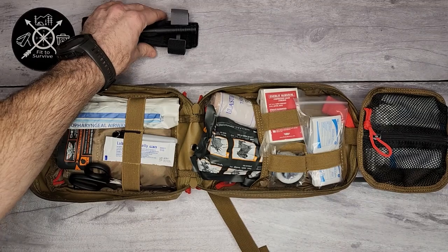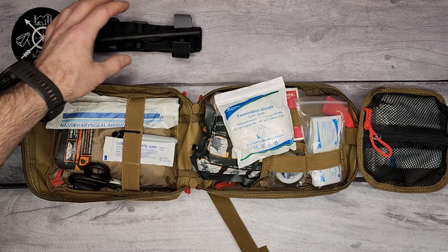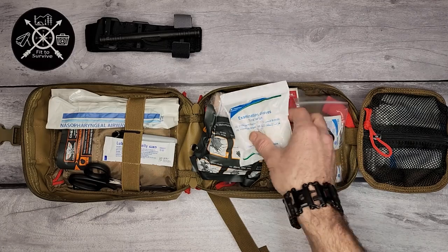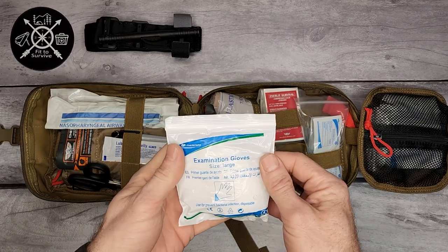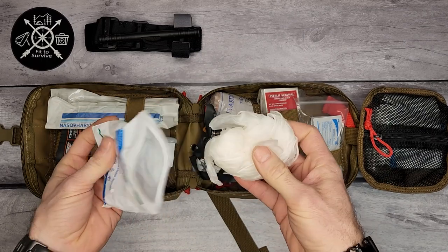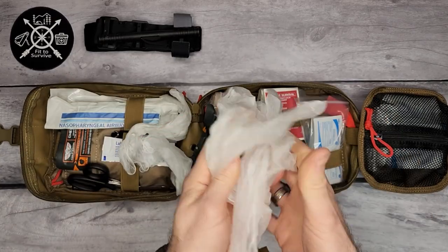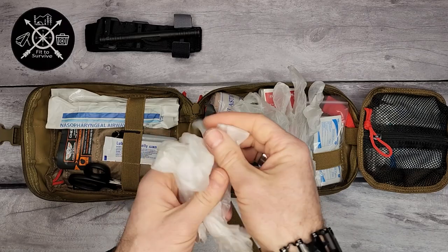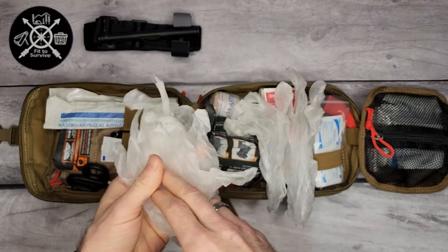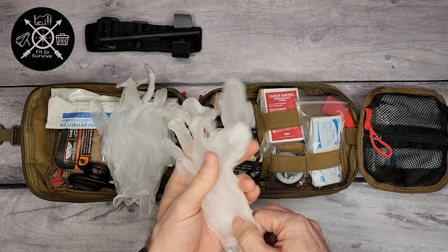You have some examination gloves here. Anytime you're dealing with somebody else's blood, you're going to want your own protection. There are two sets, which is brilliant — it either gives you a backup set in case one gets bloody, or if you have somebody helping you, which is always a good idea, that's one set for you and one set for your buddy.